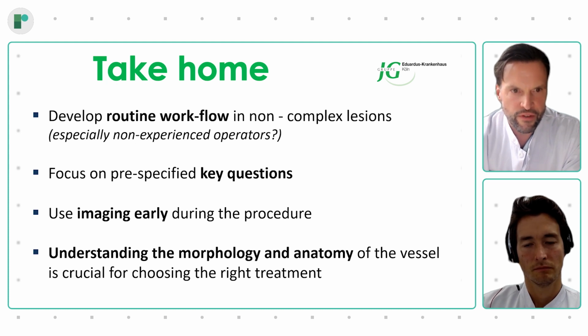You should, or you must, focus on pre-specified key questions which have been clearly defined by our guidelines, and the use of imaging is very important early during the procedure.